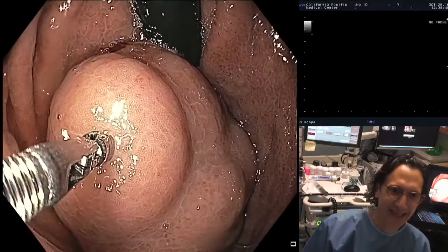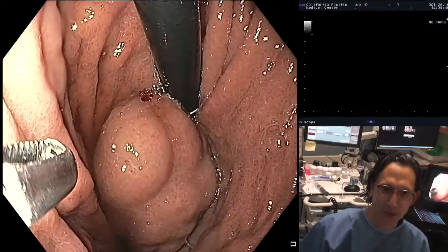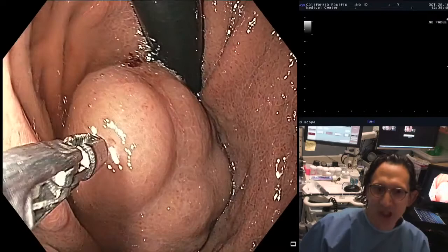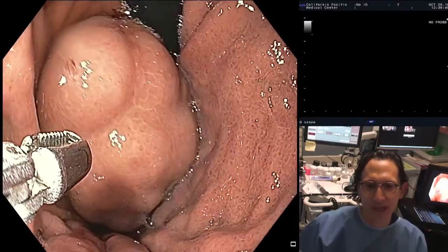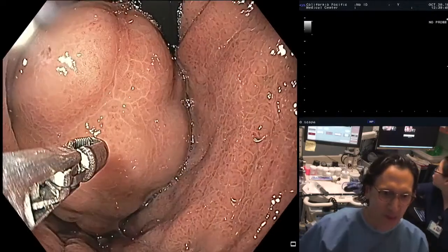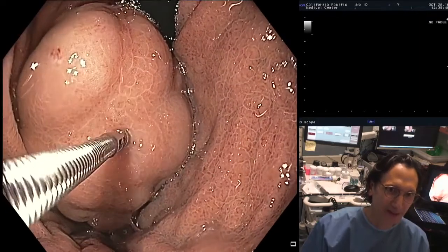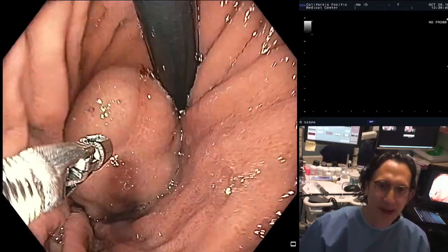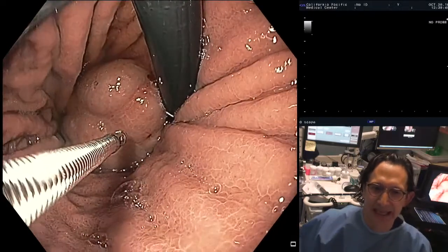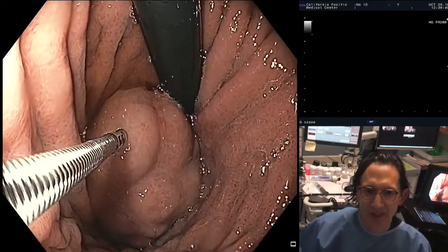All right, now let's see. Yeah. Now, I'm not going to be really aggressive here because he's got portal hypertension, portal hypertensive gastropathy, but this is hard. I didn't show you that beforehand, but those of you that have done this know when you palpate these varices before treatment, you just sink right into them. Now, this one's softer, okay? But this will thrombose. And it might be that one area that I showed you with EUS where it was not completely obliterated. I can't really get at the one up there. But this is nice and hard.